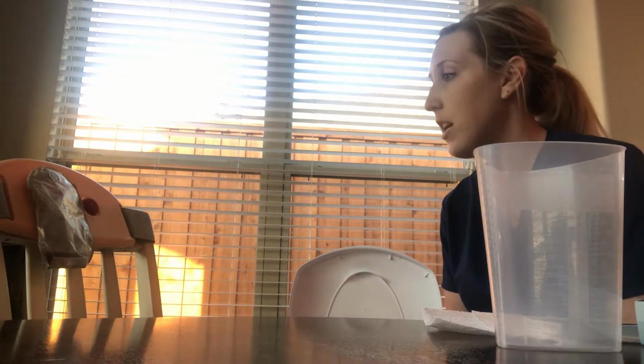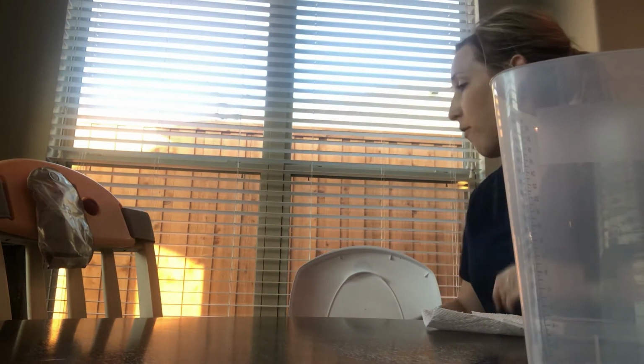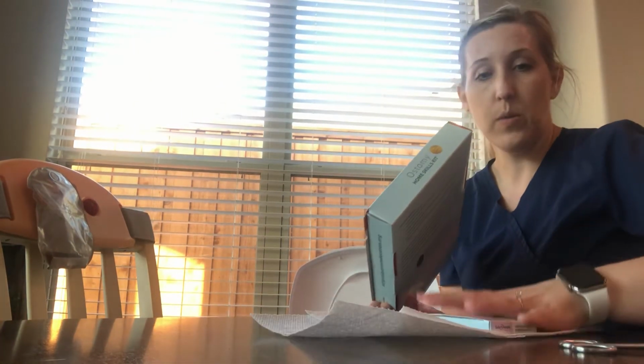So I've brought a few different things with me. I've brought a measuring cylinder, which you don't necessarily need at home. It's just an easier way to help empty the ostomy. I have brought the trash can. I have brought some paper towels for us to use around. I've also brought a peristomal cleanser and remover. And then I brought our ostomy home skill kit, which I will review with you real quick.